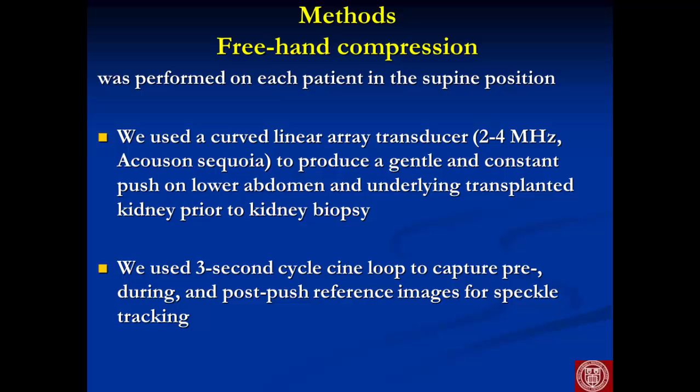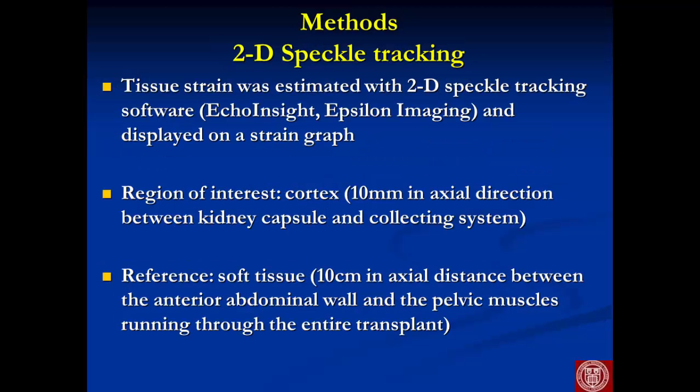We use the curvilinear transducer to produce a gentle and constant push on the lower abdomen and the underlying transplanted kidney before the kidney biopsy. We used a 3-second cine loop to capture pre-, during, and post-push reference images for speckle tracking.